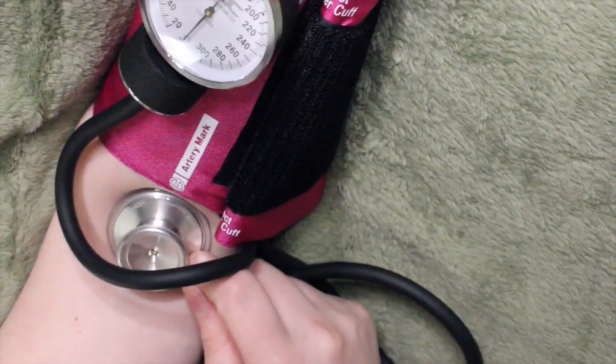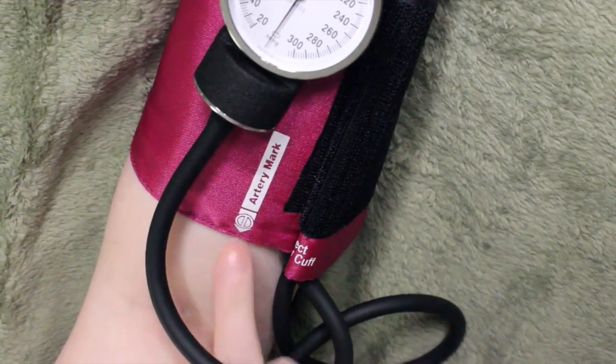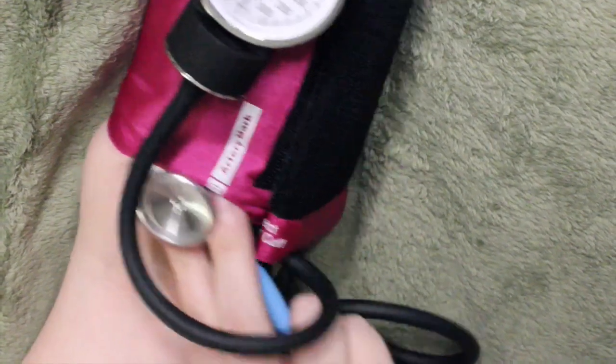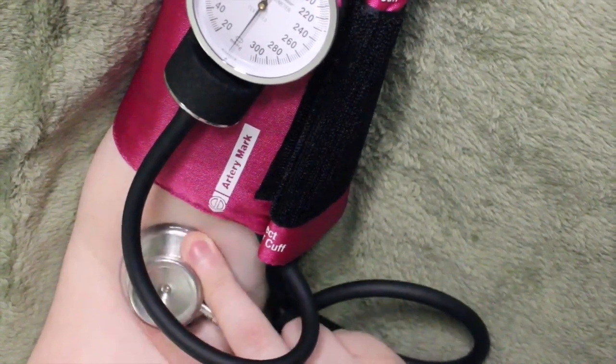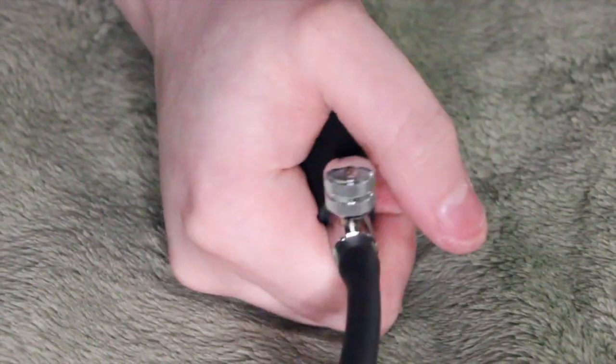Place the bell of your stethoscope in the antecubital space of the arm and hold it there. The antecubital space is just the inside of the arm, and the cuff should be about halfway up. A way to tell if it is too low is if you have to place the bell of your stethoscope under the cuff to take a blood pressure. Then make sure the air release valve on the blood pressure cuff is closed and begin pumping up the cuff.